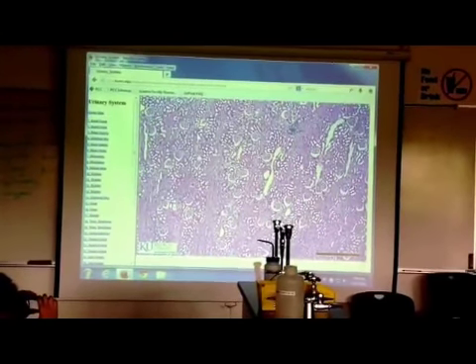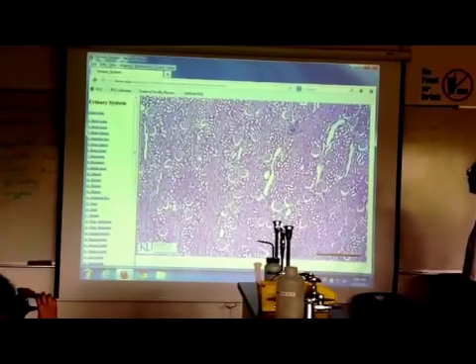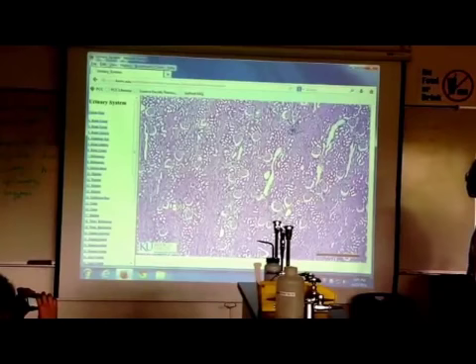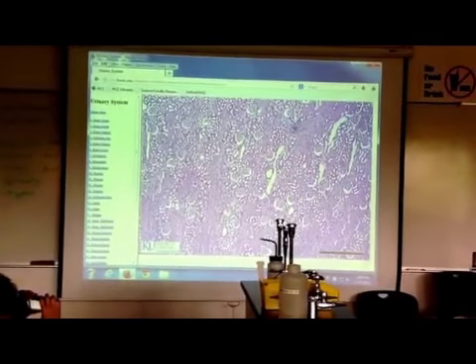What's that dark spot up on the top right? The really dark circular. I see. I don't know. Okay. Just a weird spot. Some kind of weird spot. I don't know. Okay. So you have the corpuscle, kidney, tubules.